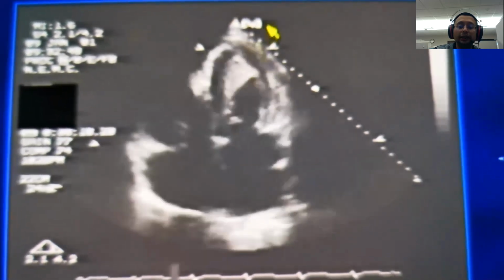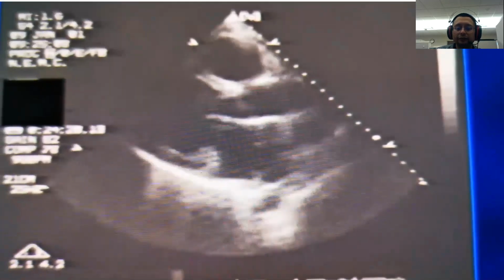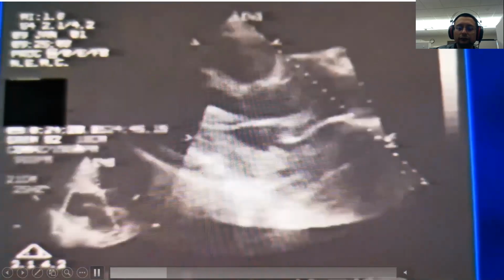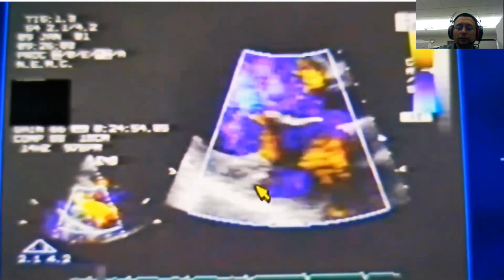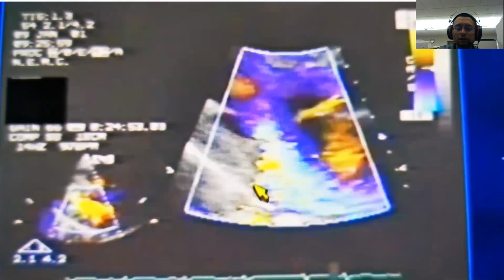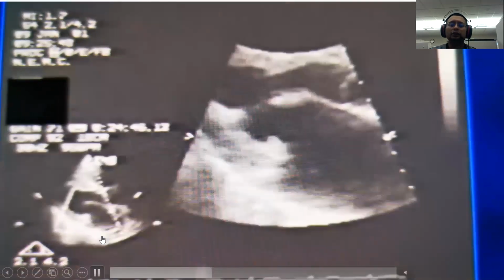Is that an MR? Yes, there is mitral regurgitation as well. Okay, there's mitral regurgitation. Look at the next picture here. So what do you see in that posterior mitral valve leaflet there, Sarah? Calcified, restricted. Okay, can you comment on the leaflet itself? Disjunction. Okay, the disjunction is when the posterior wall has a distance from the posterior mitral valve leaflet. So this is not disjunction. No.